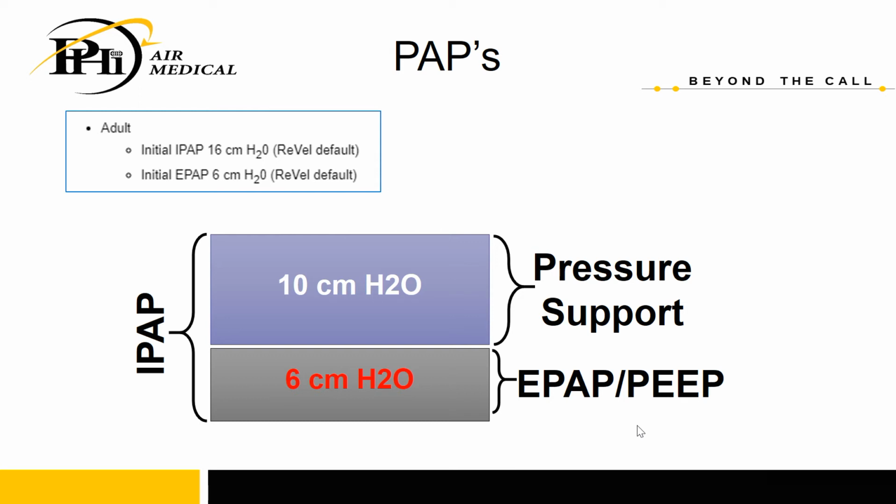A good rule of thumb with the delta is that if you have somebody who's tired, you have a COPDer, they typically want a pretty high delta of about 10 or so because they're tired, they want that inspiratory help, but they typically don't need a very high PEEP. So 16/6 or 16/5 would probably be pretty good for most of those people.